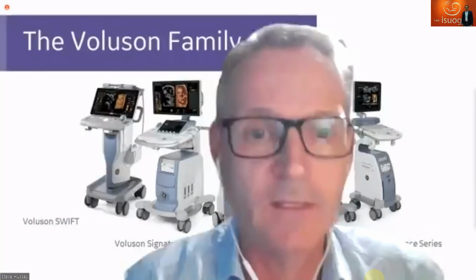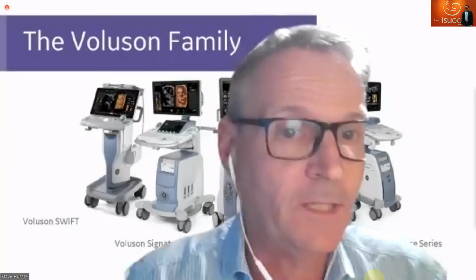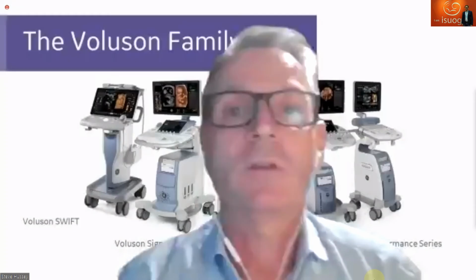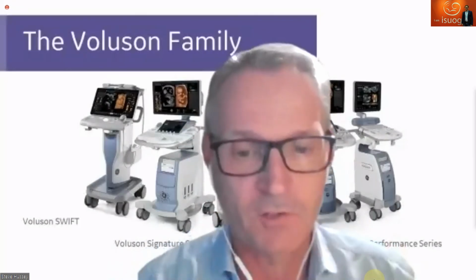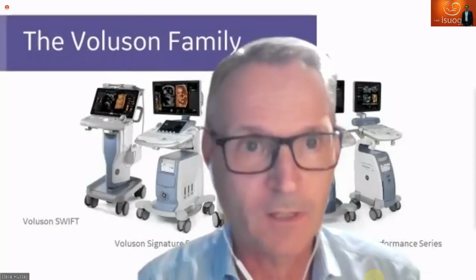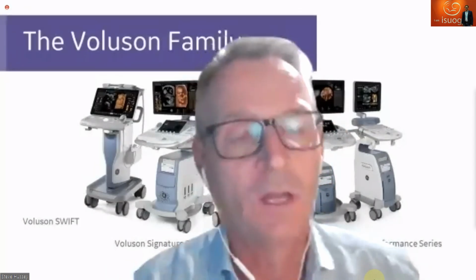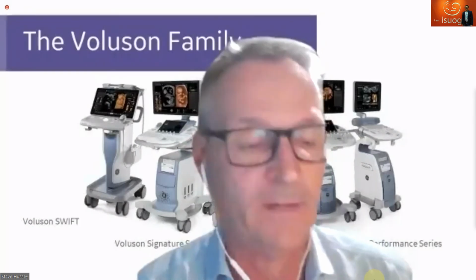There's a number of technical questions and a number of questions related to anatomy. So would you like me to read them out, or are you quite happy to read them out first? No, you go ahead. Okay, we'll take the first technical ones first. I think because you optimize your image so well, a few people are confused as to which probe you are using during the examination. So do you use a convex probe, or a sector probe, or a linear probe for your examinations of the fetal heart?